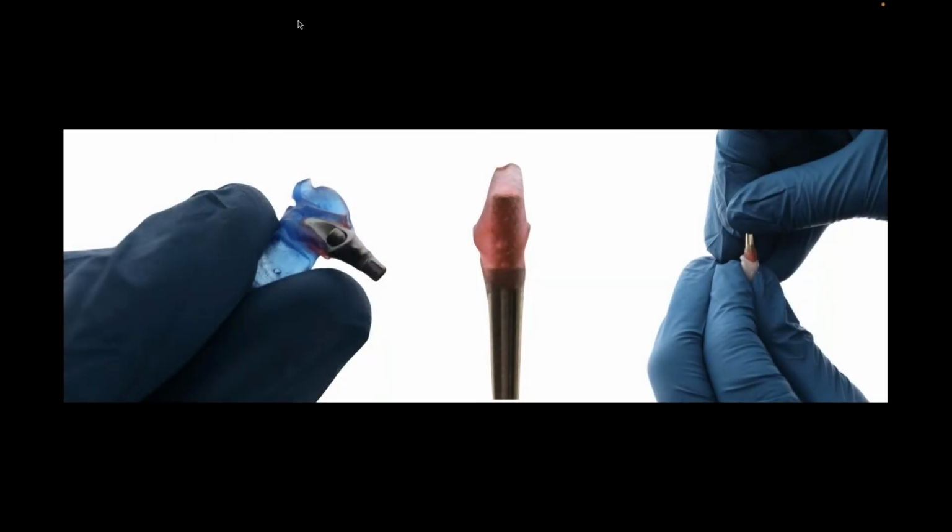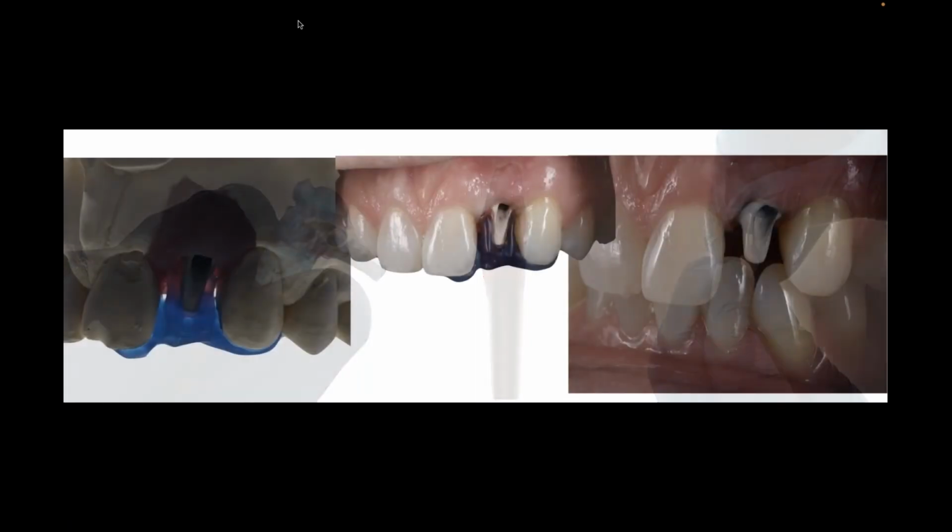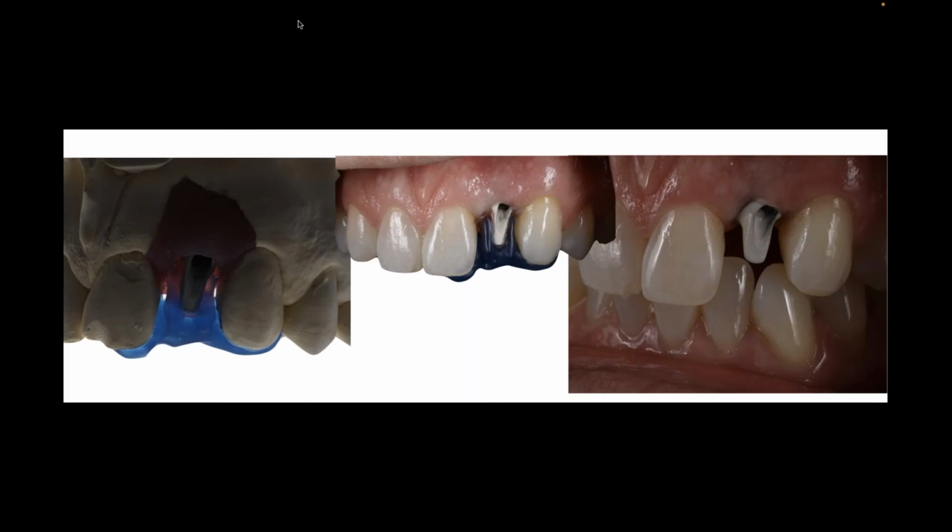This implant was done. It was actually an interesting case because we made the abutment, we made our implant verification jig, right? So that the doctor can put that from the model straight to the mouth and verify that the abutment position is correct. We made our plunger to make sure that we're not putting too much cement in the implants, all the things that we would normally do. And everything worked out pretty well from what I thought.